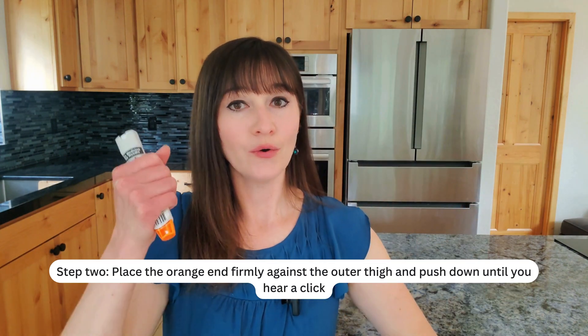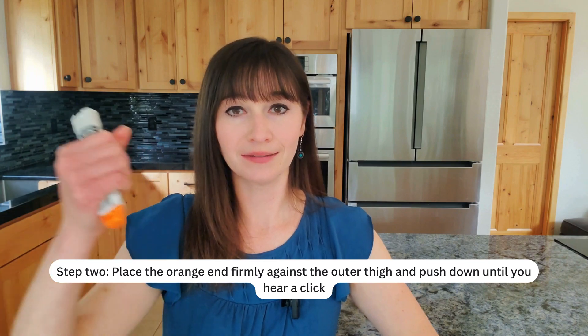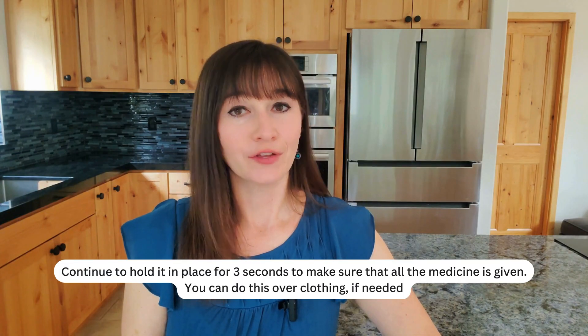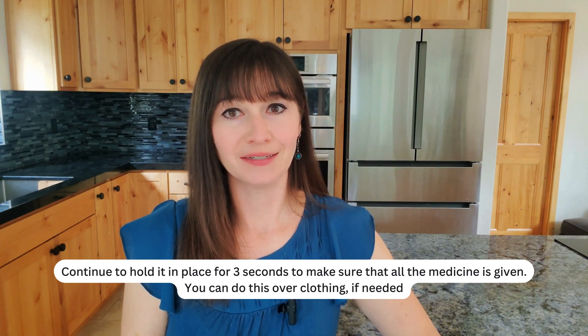Step 2. Place the orange end firmly against the outer thigh and push down until you hear a click. Continue to hold it in place for 3 seconds to make sure that all the medicine is given. You can do this over clothing if needed.